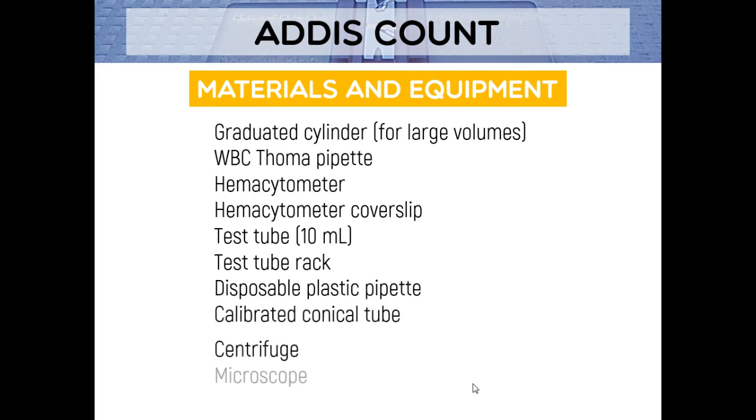And again, we have the calibrated conical tube because we use this for centrifugation because we want only the sediment, di ba? After centrifugation sa atong ihi, makita tong sediment, mo tong i-examine. And again, wala man tayo conical tube. I can't recall the conical tube sa CM before, so the normal test tube will suffice. Okay na to siya. And of course, centrifuge for centrifugation and microscope.